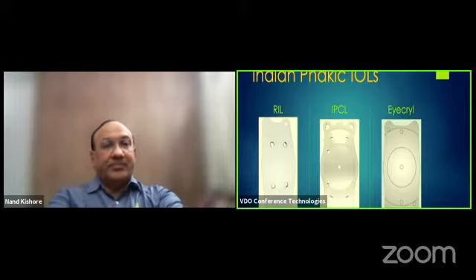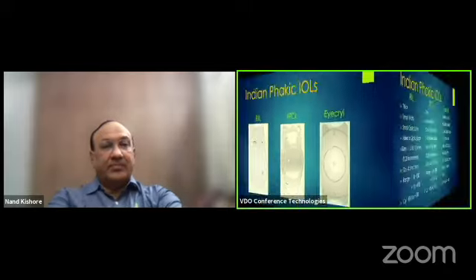It's reversed in the case of IPCL and ICL. The Appasamy lens has 4 holes at the margin of the optic. IPCL has 4 holes at the optic junction, and in addition to that, it has 3 holes. Biotech has only one center hole.